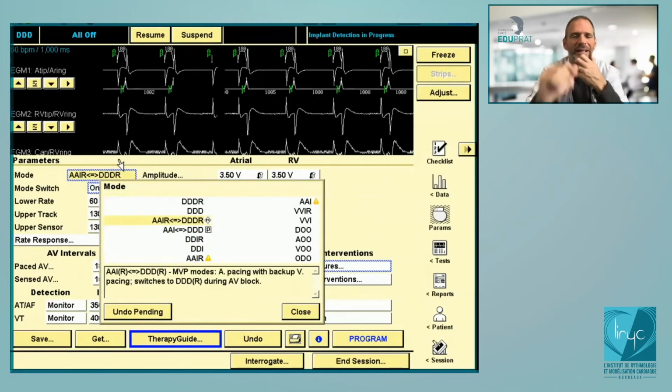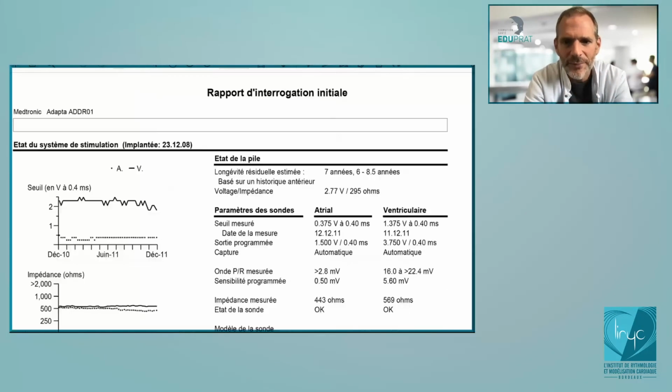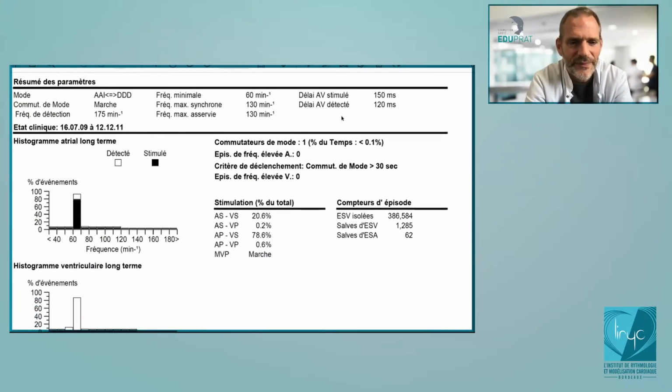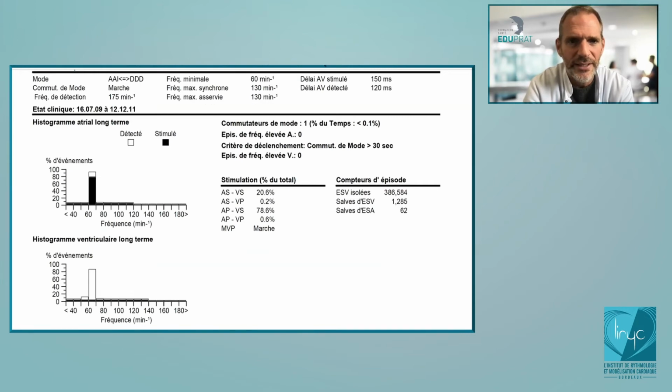If you don't mind, I will share my screen now. I'm sorry it's written in French, but what do you think about that? This is the interrogation of a patient with sinus node dysfunction. What do you think? The patient is symptomatic during exercise, saying, okay, I'm not feeling so well during exercise. What do you think about that?